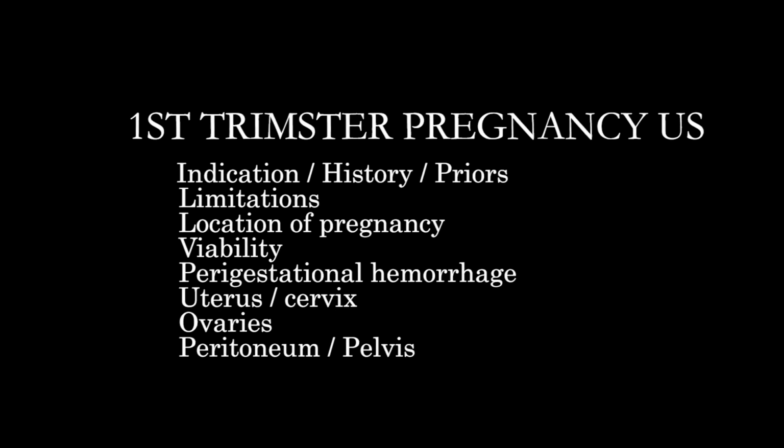I'm mostly going to be focusing on the addressing of acute complaints for early pregnancy. Routine imaging of pregnancy is frequently done by OB-GYN. This is really focused on the addressing of any sort of concerns that occur in that first trimester. These can be pain, bleeding, or when we don't know the location or viability of the pregnancy. So this is the sort of study that will be requested of radiology.